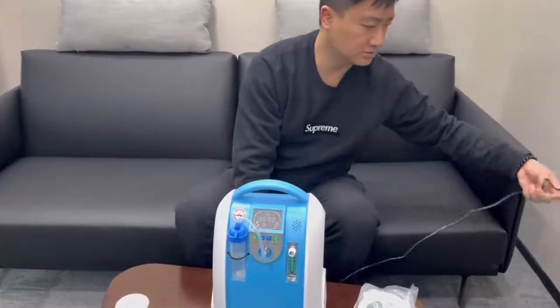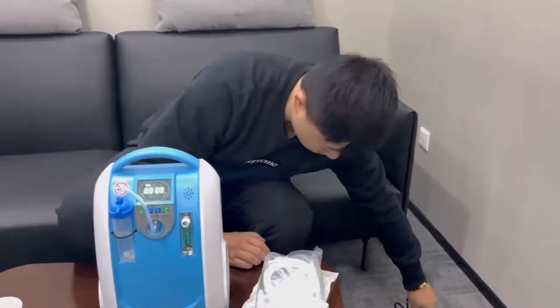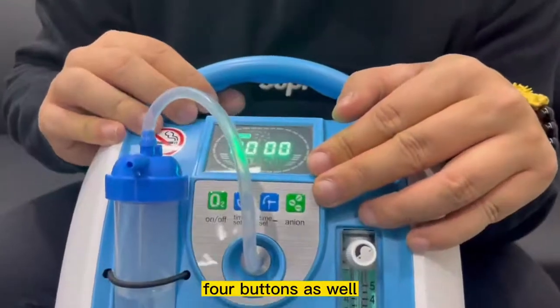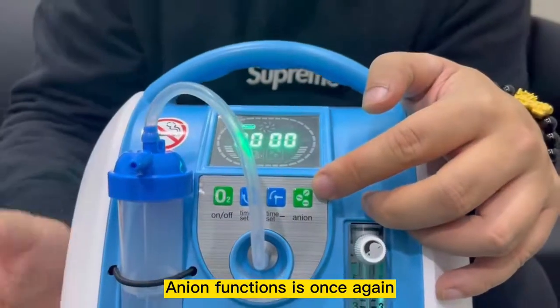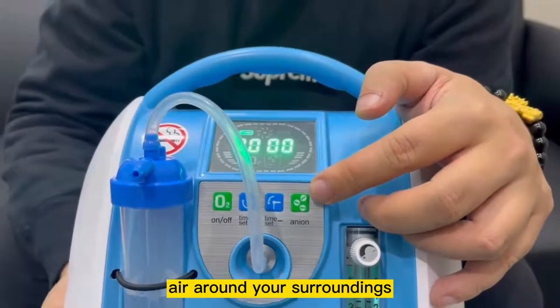Next, you can just turn on the machine. When you turn on the machine, you can see the on/off button as well — on/off button, timing button, timing off button, and the ionizer function. The ionizer function is for when you're not inhaling oxygen; you can just turn it on and it will help to purify the air around your surroundings.